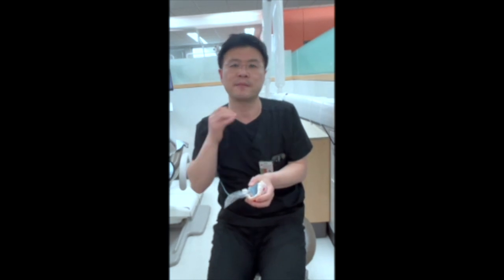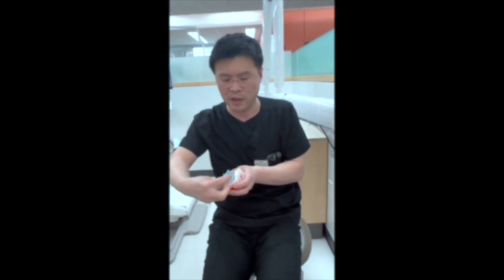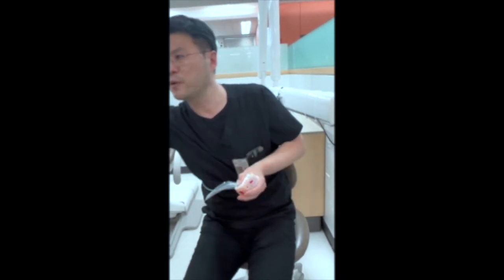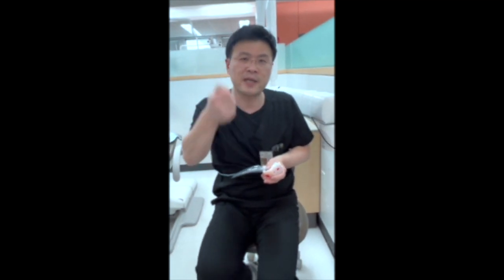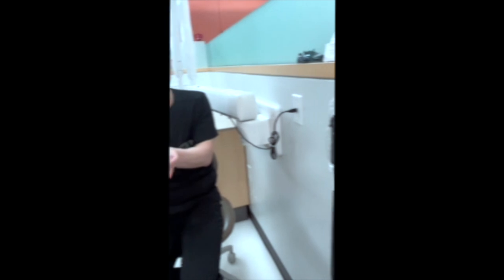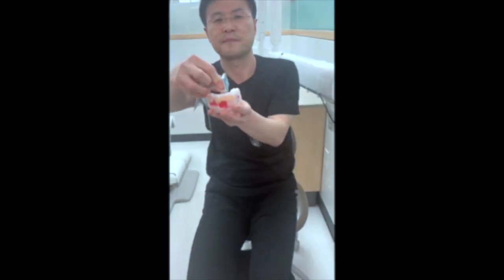The mylohyoid muscle pushes up and can dislodge the sensor. By the time you press the button to expose the radiograph, you may realize that the sensor is already pushed up, which often will just give us the view of the crown, which is not helpful in endodontic therapy.